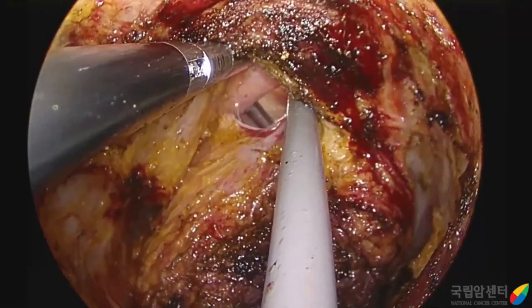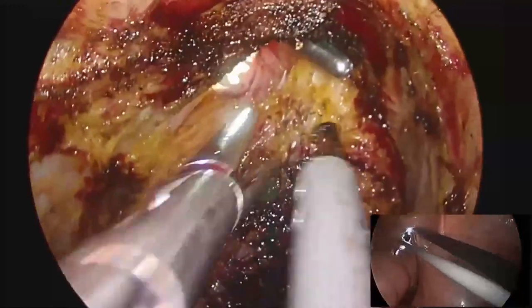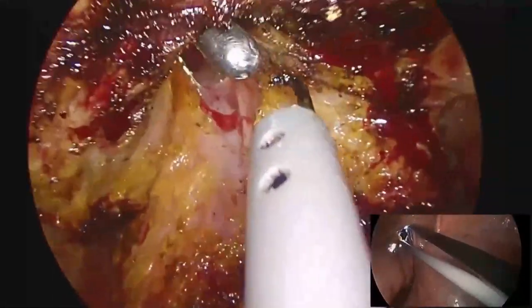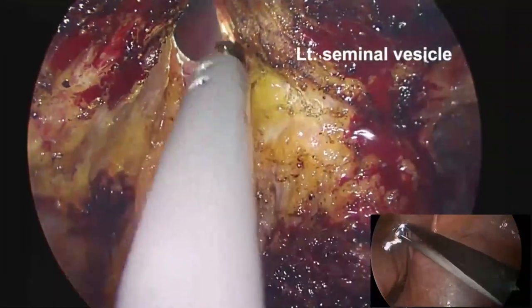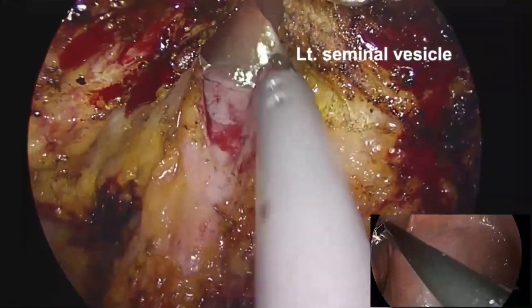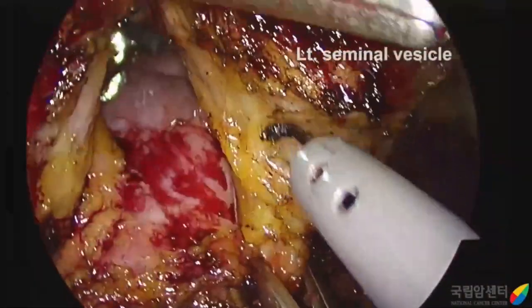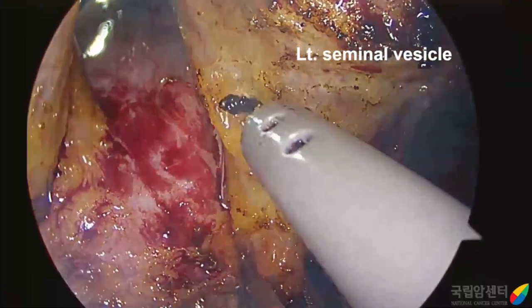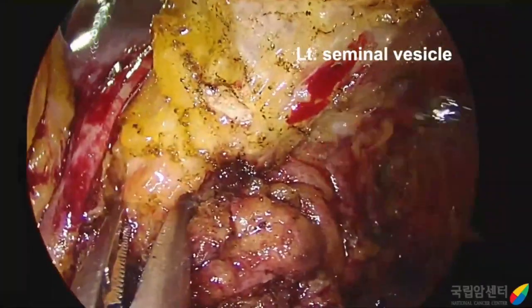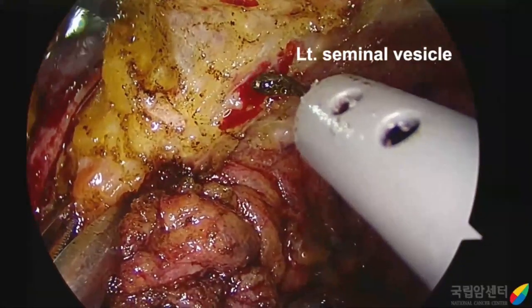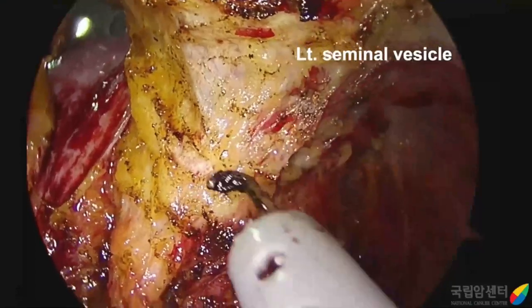After we widen the opening of the peritoneum, the two teams continue working together until the rectum and sigmoid are completely free. During dissection of the anterolateral side of the pelvis, we should be careful not to injure the neurovascular bundles.